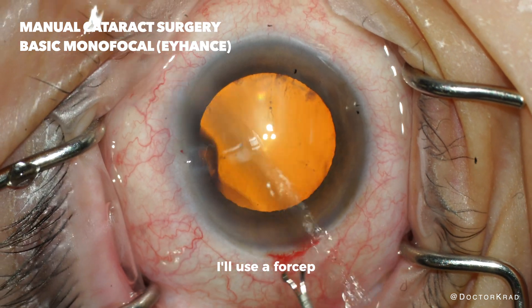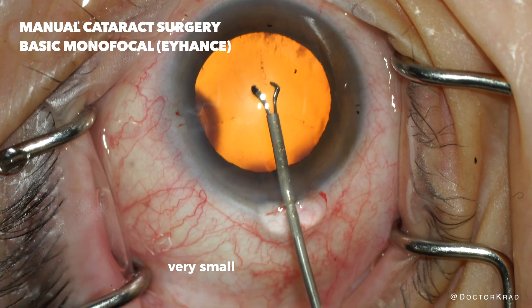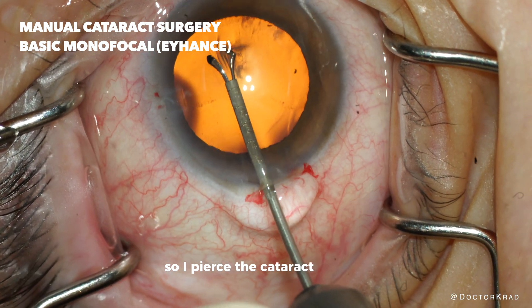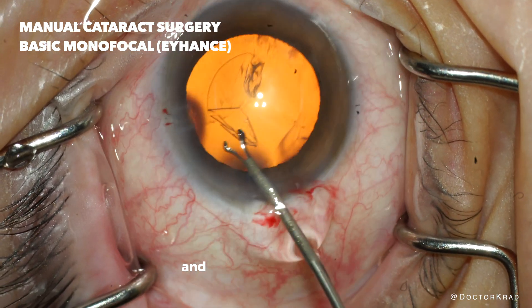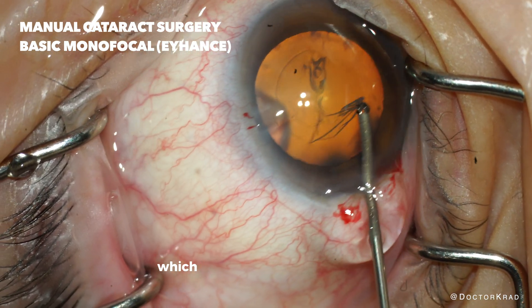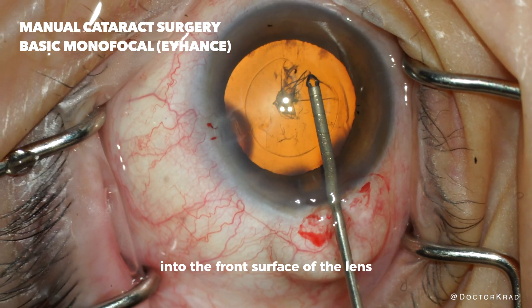I'll use a forcep — a micro forcep, very small, and it has a sharp tip. So I pierce the cataract capsule and then just grab it and do my capsular rhexis, which is the round opening into the front surface of the lens.